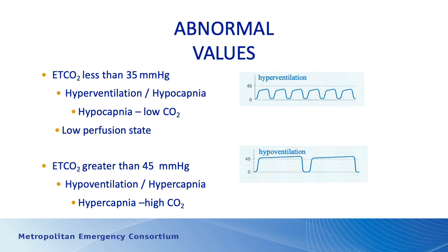It's possible that if you have a patient with diabetic ketoacidosis or sepsis, they're in a low perfusion state, plus they're hyperventilating, and you'll see the same graph, same waveform as you're seeing here for pure hyperventilation.